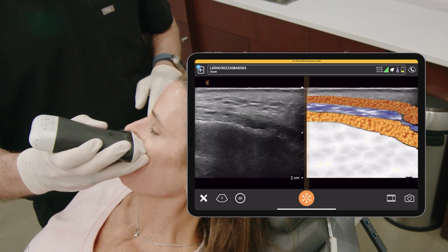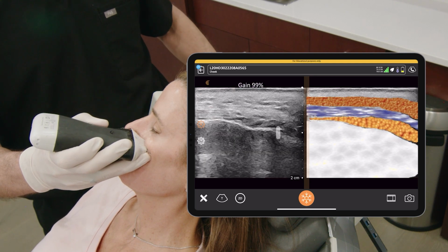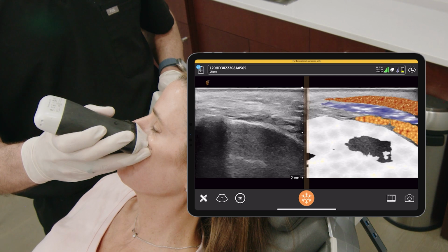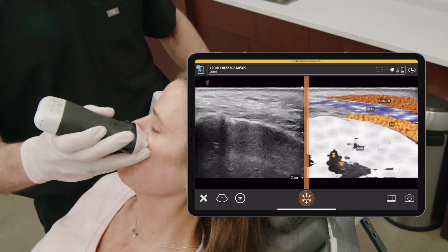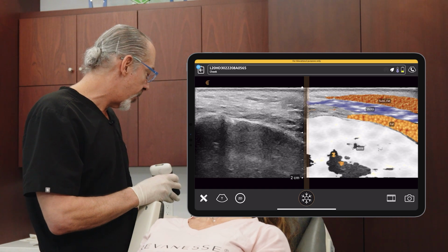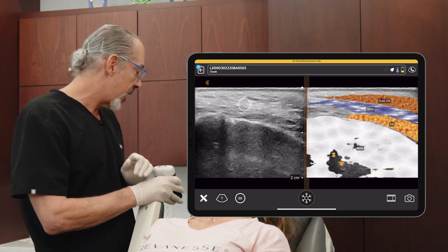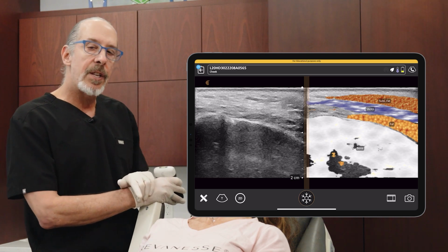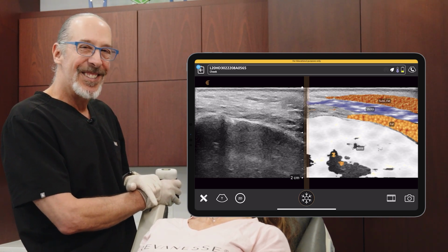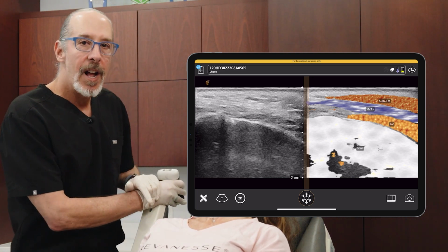And as I described earlier, here is the T mode over here. So I showed you before what the SMAS looks like. So the SMAS is going to be right here. And I showed you what the deep fat and the subcutaneous fat look like. So it's spot on, just as I told you before, without using AI. Good job, Clarius. So that concludes the evaluation using T mode of the cheek.